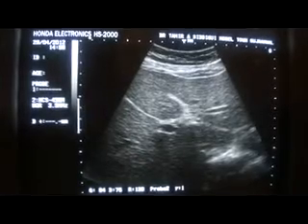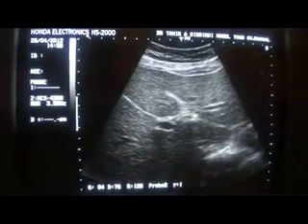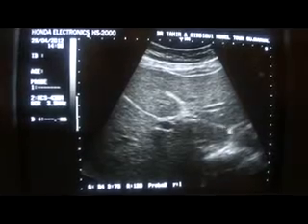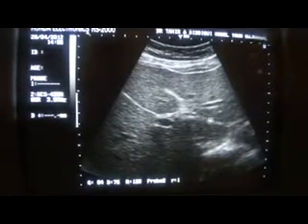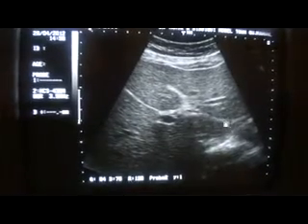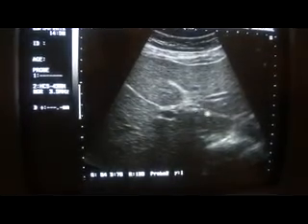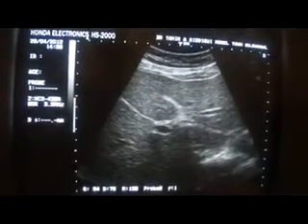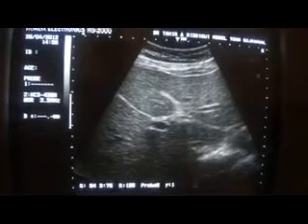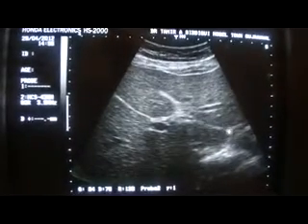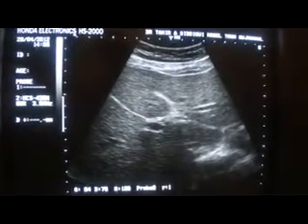Now this linear structure that I am seeing is ligamentum teres. As I am moving the probe, it becomes longitudinal and it attaches to the left portal vein. This is the ligamentum teres — it attaches to the left portal vein.